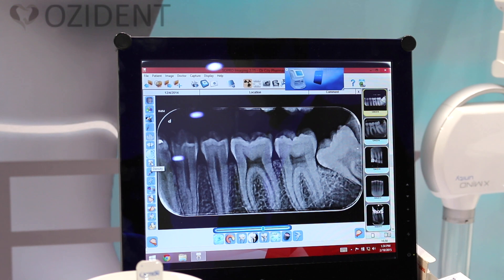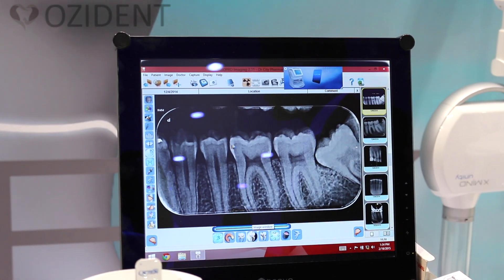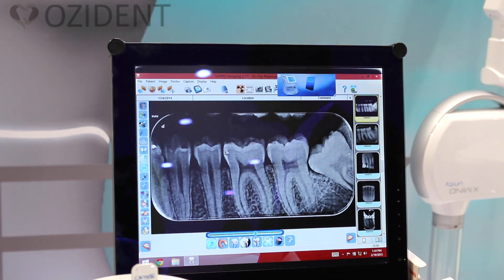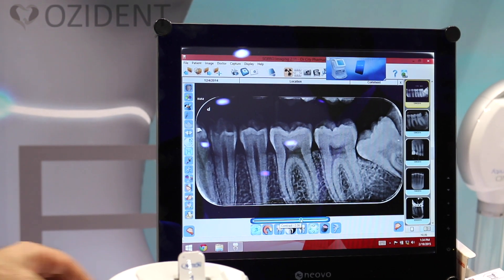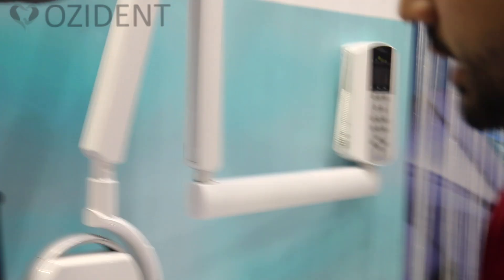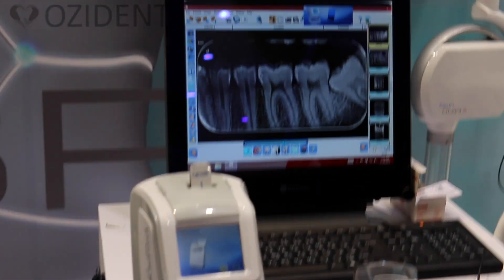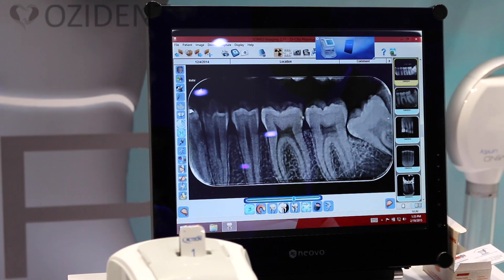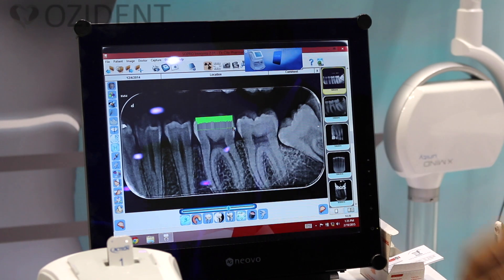Here you have the density tool. It's not exact like a 3D machine, but you can get an idea of the tooth density. When you click on it, your cursor changes and you draw a line — for example from here to here — and you can see the tooth density along that line.